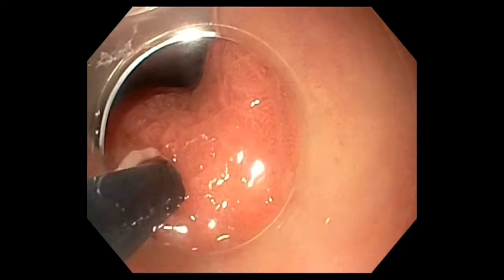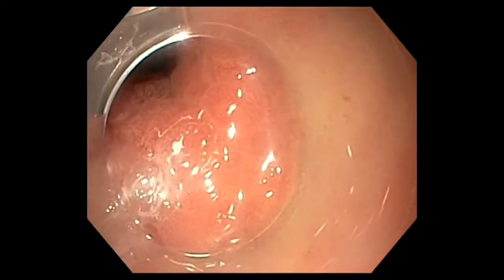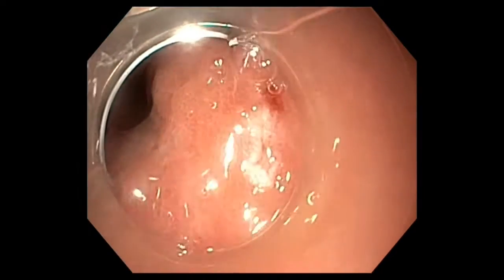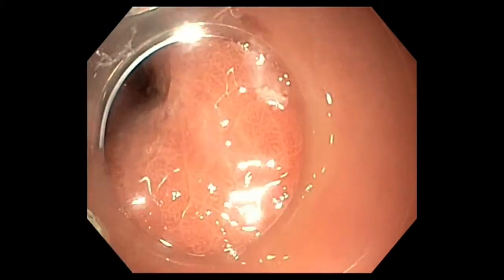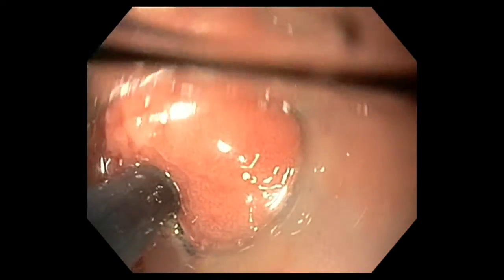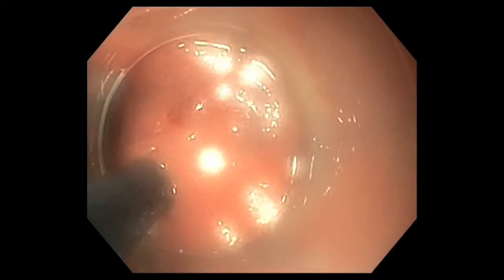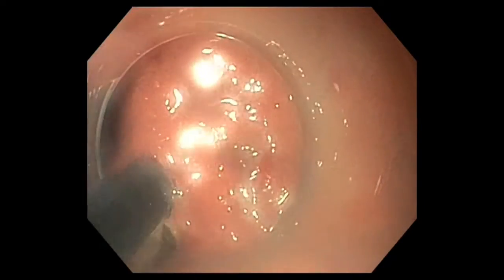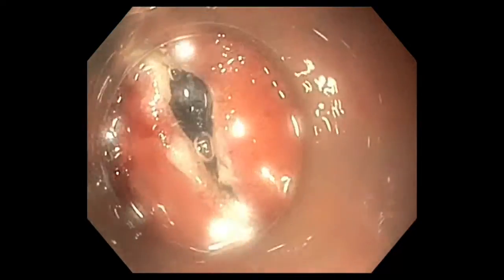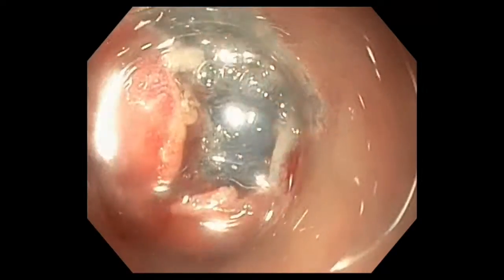After inspection, small markers were placed and the lesion was lifted using a mixture of Voluven and indigo carmine. A horizontal incision was made at the oral side of the tumor. The plan was to make a horizontal opening in order to create a submucosal tunnel.